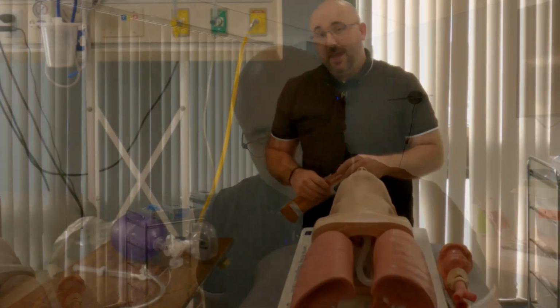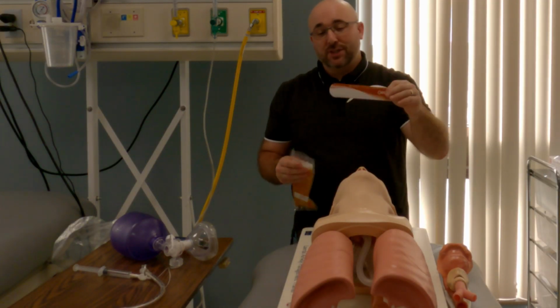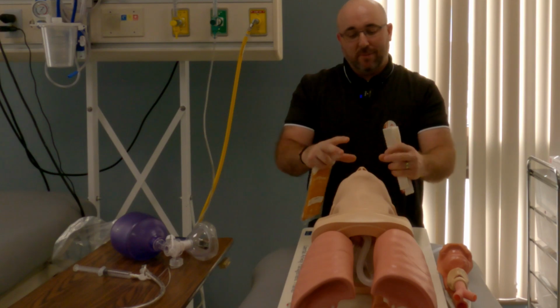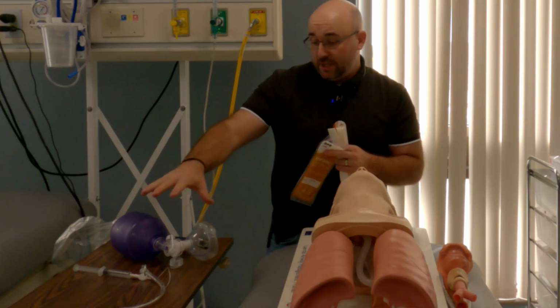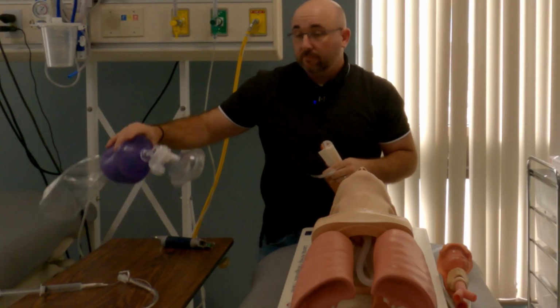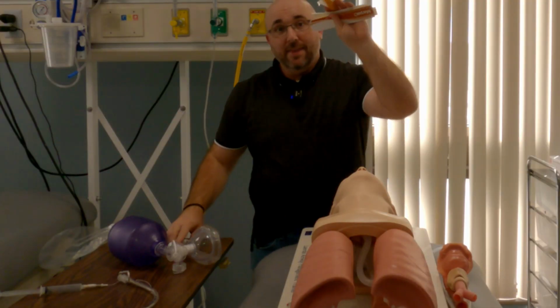Now let's go back over to the mannequin so I can show you how it's going to work when you're assisting. And the fourth piece of equipment that you need when you're assisting is some type of securing device. This is a Marpac securing adhesive tape. Sometimes you have a commercial device that will go on there, but those are the 4 different items that you'll have. Endotracheal tube attached with the syringe and the stylet. That's one. Bag valve mask here, laryngoscope blade and handle, and then your securing device.